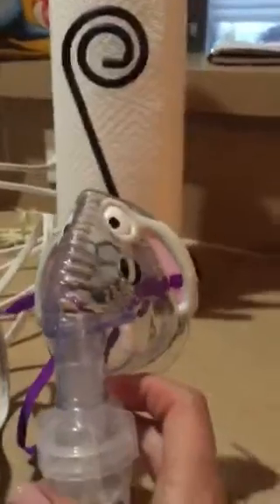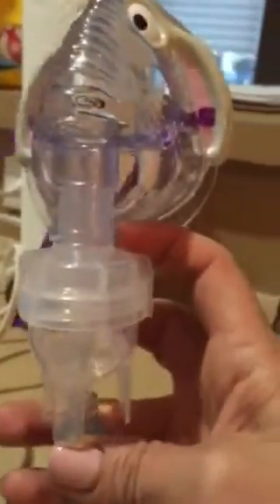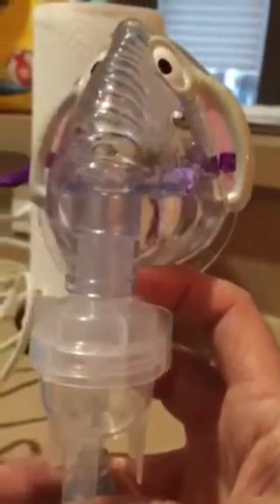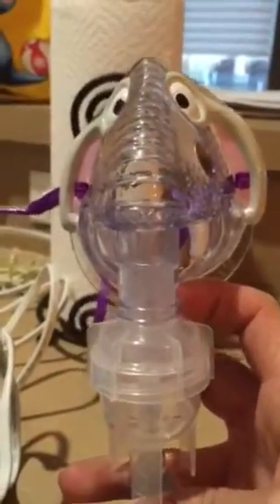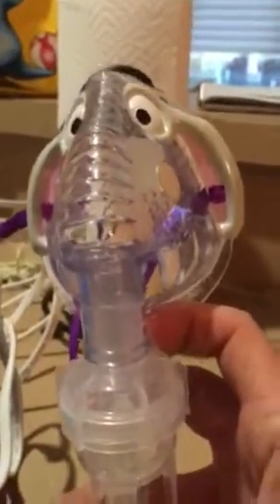Just turn it on and it's gonna smoke and do the steam. They said you're done when you can't see any more liquid in the bottom or you see it stop smoking. Sometimes while it's on her face you might have to jiggle it a little bit and more steam will come out. I'll show you another video once we get her going.